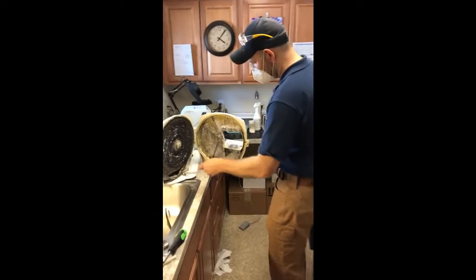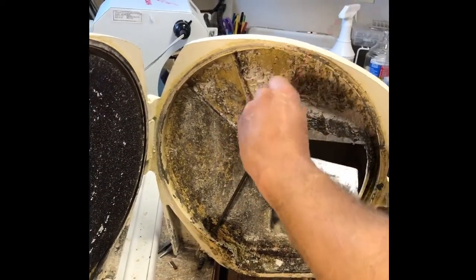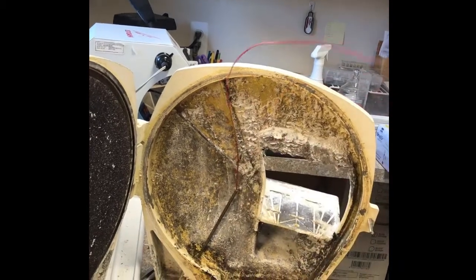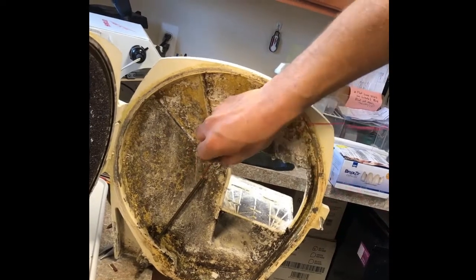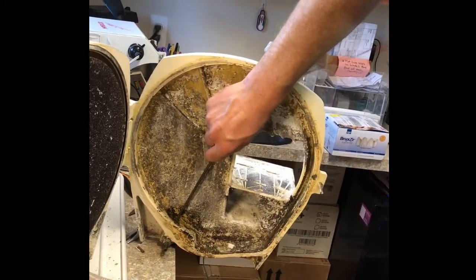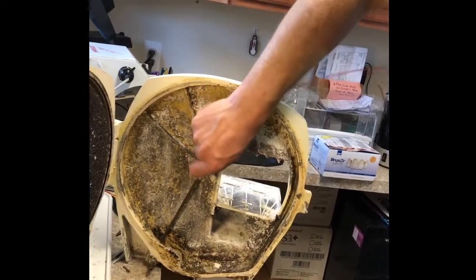Okay, and then all we're going to do is thread that in the top. First we'll work from the top down, like so. This could be a little bit shorter, but it's what we've got. So we'll get it kind of shoved down in there, all the way until it stops, and then we'll just spin it a little bit. I think what we're kind of fighting against is some of that calcification.